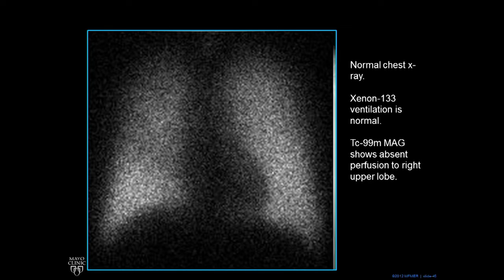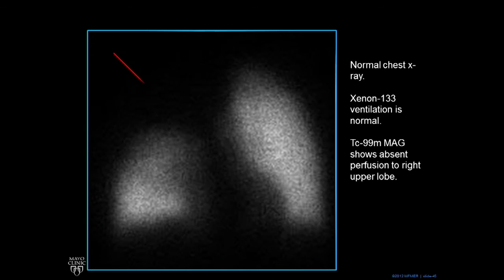Now we switch to a perfusion tracer. Again, we see the cardiac silhouette in the middle. We see the left lung is all taking up this perfusion tracer, showing where the blood flow goes. But on the right, we have a big empty area in the right upper lobe — there's no perfusion to the right upper lobe.